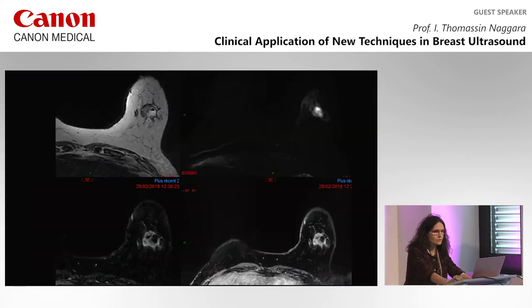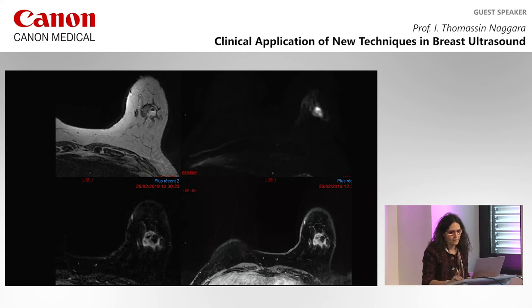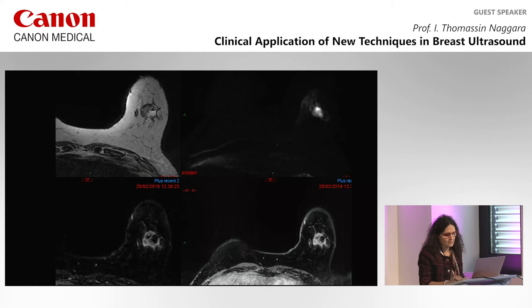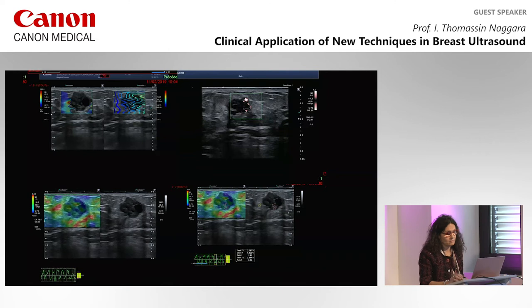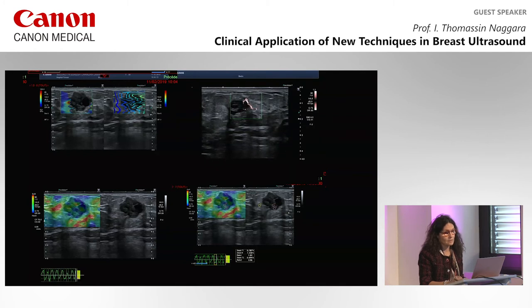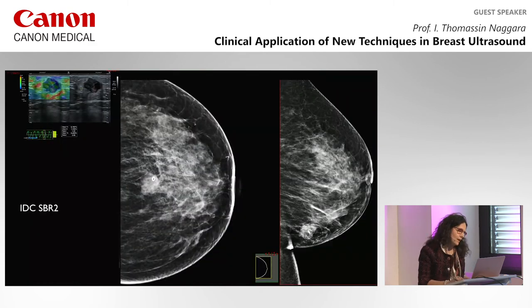Here is another example: a lesion detected on MRI with a bright signal on T2, suggesting a soft lesion. On elastography, the lesion is quite stiff. On SMI, there are peripheral and branched vessels, making it potentially suspicious. This lesion was an IDC SBR grade 2 cancer.